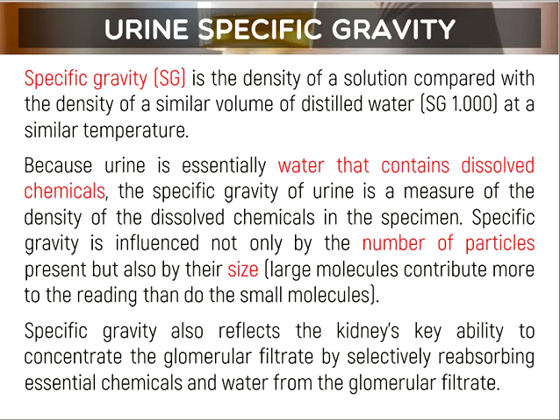As I said earlier, color is directly proportional to concentration, and inversely proportional to its volume.